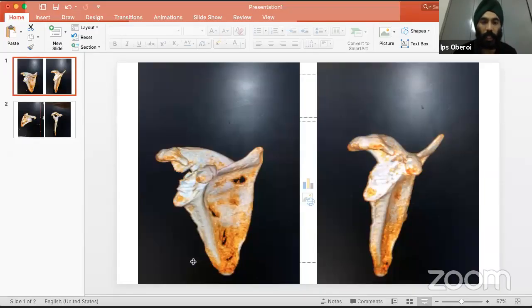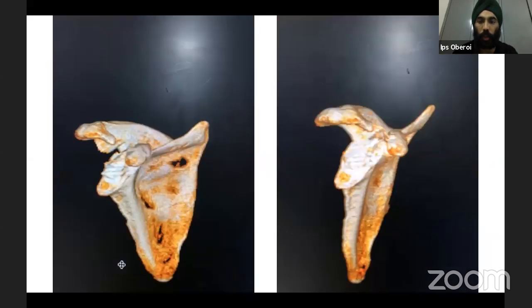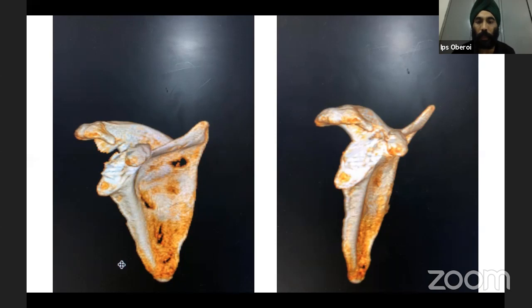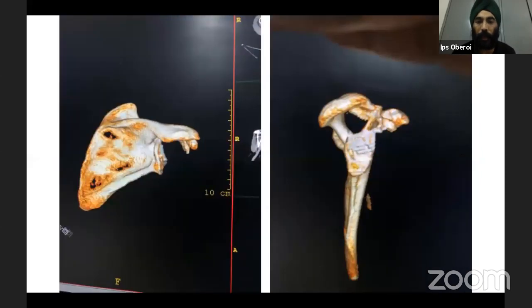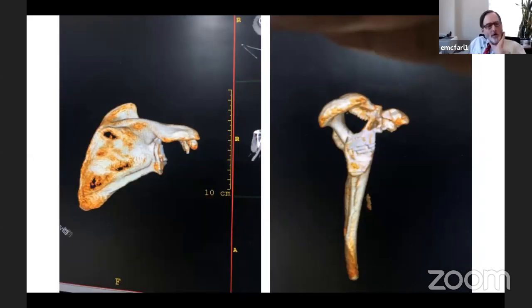So, Professor, these are 3D CT films of a glenoid bone loss, which is going right till the coracoid process. That's a rheumatoid shoulder. We have just got these 4 pictures, not more than that. So would you actually go medialize till the base of the coracoid, or would you actually augment it? That was the question which the delegate had asked. Frankel talks about medializing and putting a screw through the base of the scapular spine here.